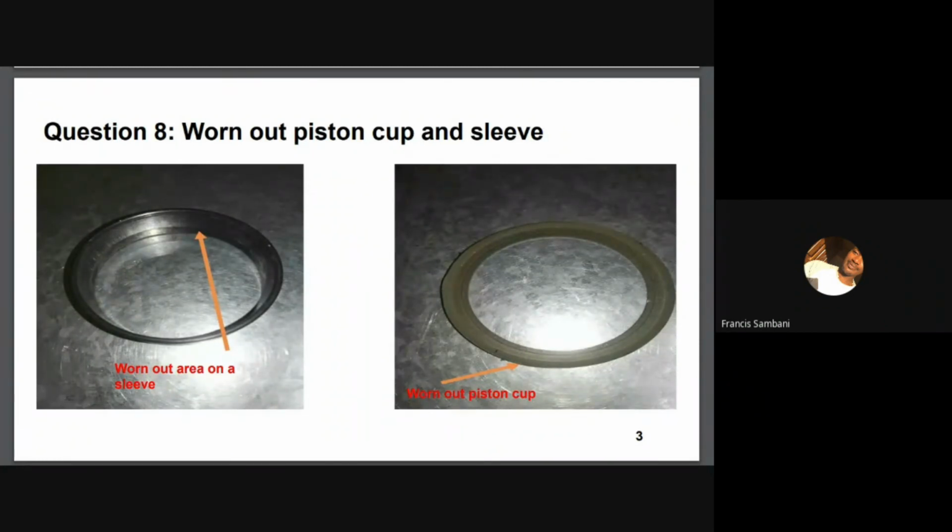So just remember to check for leakages, because you'd have refilled the beds, and that gives you room for leakages. So just check for leakages as well, and that should solve your problem. Thank you.